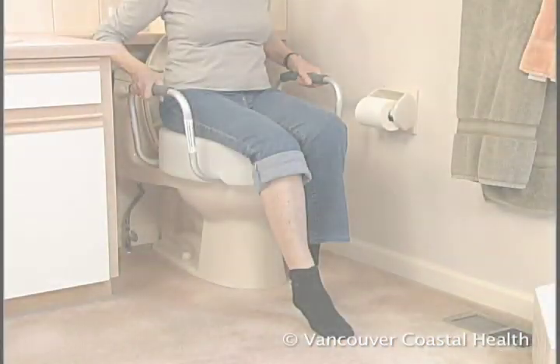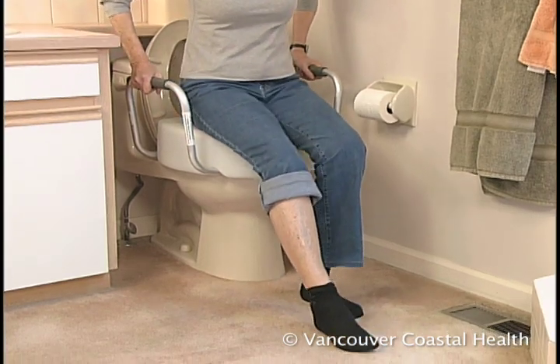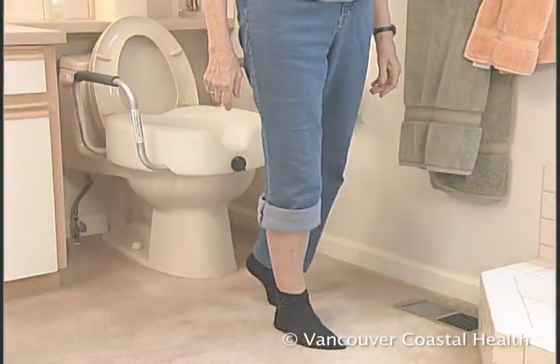To get up, slide forward on the seat, extend your surgical leg. Then use your good leg and arm strength to push up. Make sure you press up on both armrests so that the device remains steady.